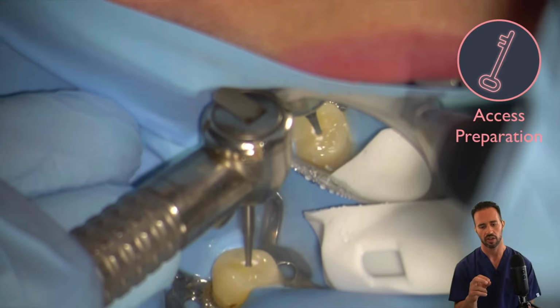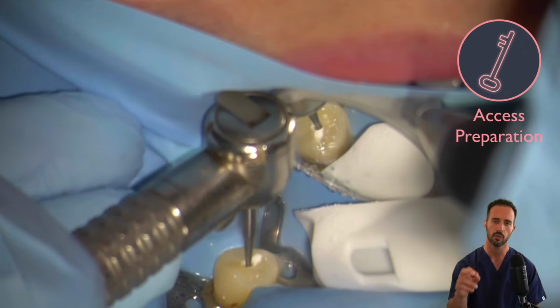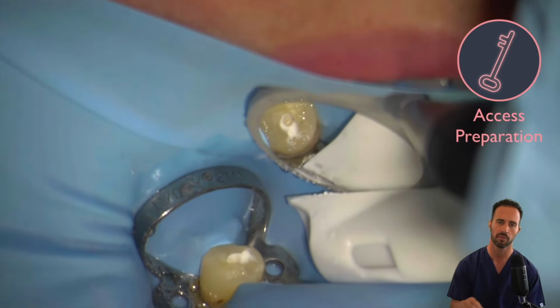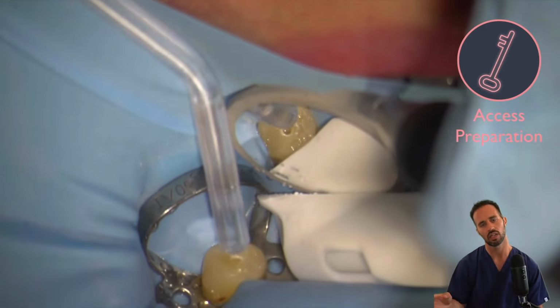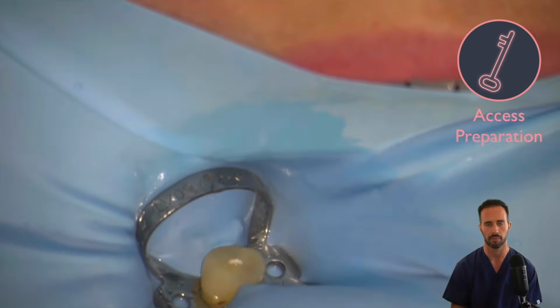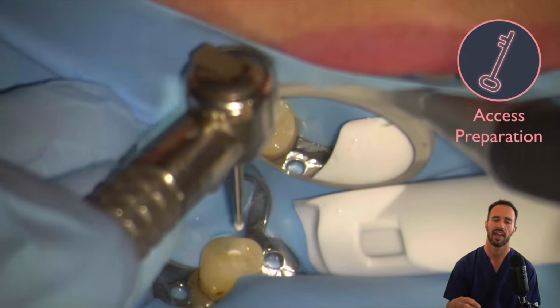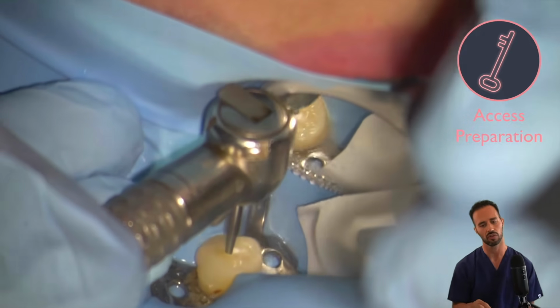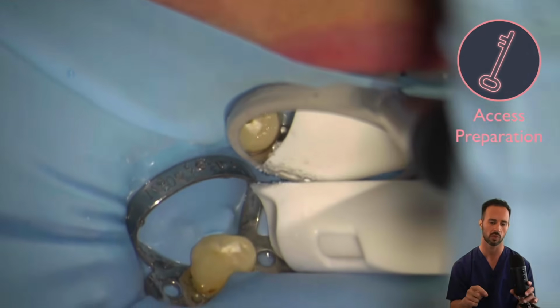And so we're starting here with our size 2 surgical length round burr, and we want to prepare dead center in cases like this. So you're going to slowly progress towards the chamber of the tooth. If you need to clear away some of that dentinal mud or debris, do that periodically so you can see very clearly the angulation of the burr and exactly where that burr is penetrating into. And pretty soon you'll feel a little drop right when you get into that pulp chamber. That's what you're looking for.